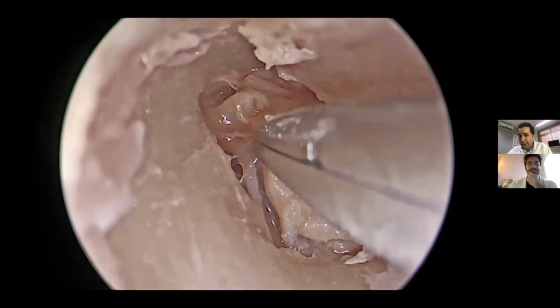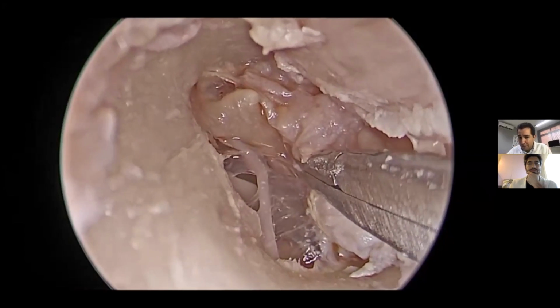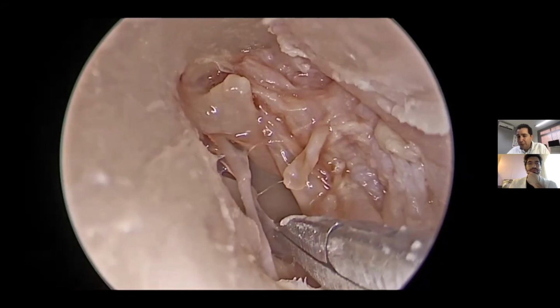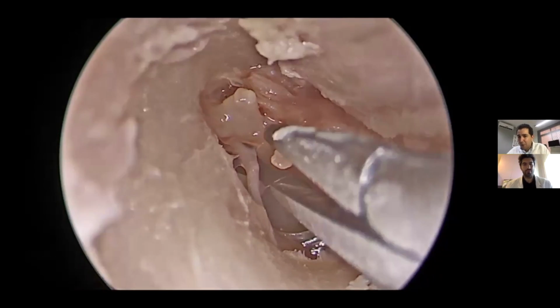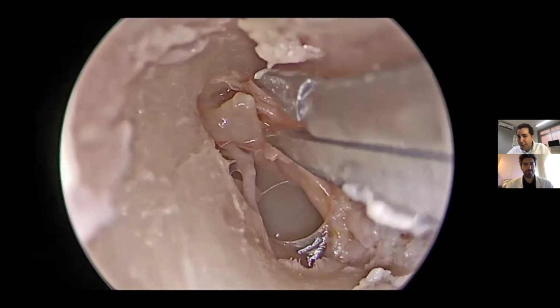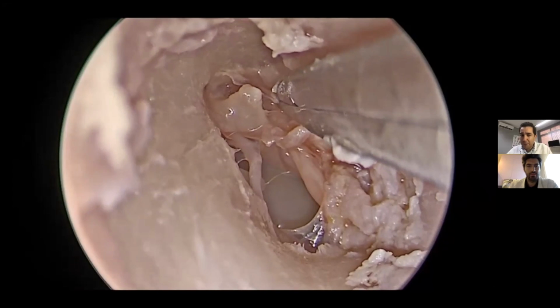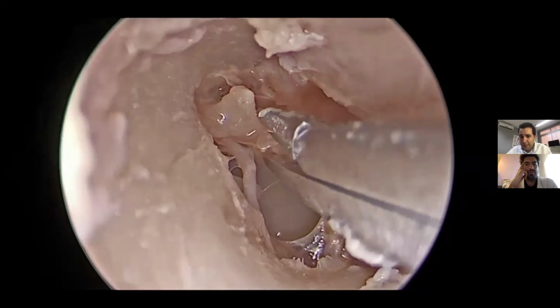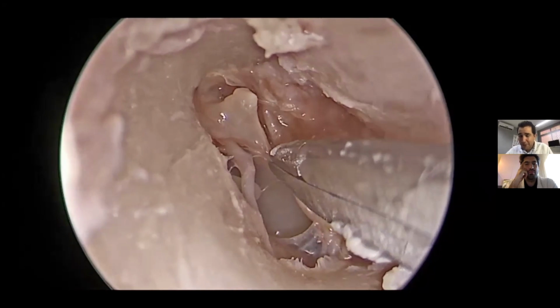This can be done in a cadaver. Actually, it is more difficult than in real life. In real life, this is not very difficult. It can be done, and then you can elevate this tympanomeatal flap completely from the malleus, or leaving it attached to the umbo in order to have a very good view of the middle ear to inspect the anatomy. So we are elevating. Of course, I'm not very delicate here. As you can see, we are mobilizing a little bit, or a lot, the ossicular chain.